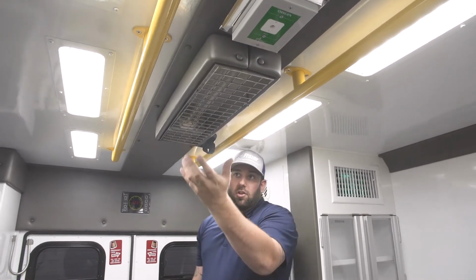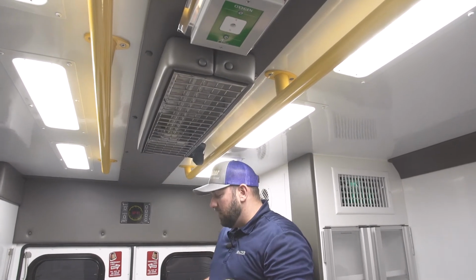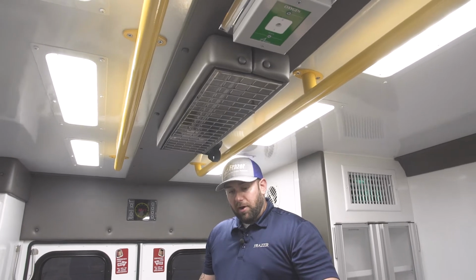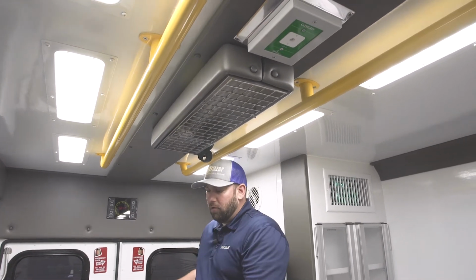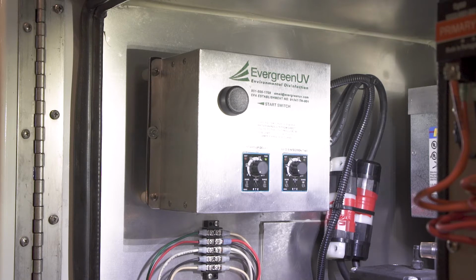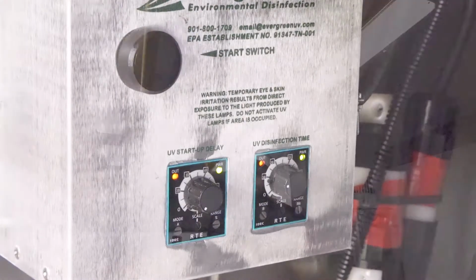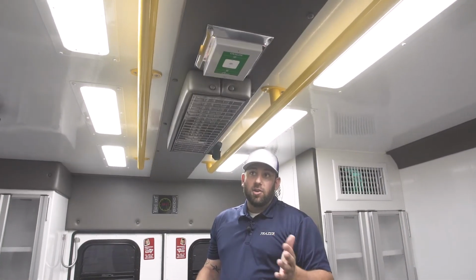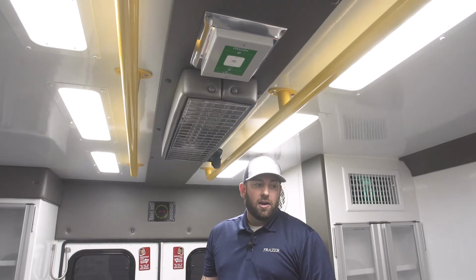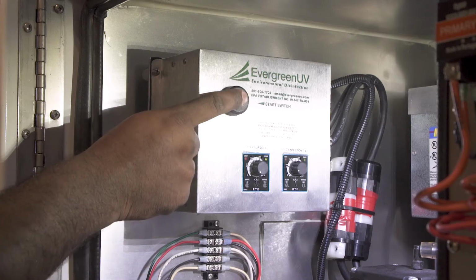So the light fixture is here. To activate it, all the doors have to be closed, and no people are going to be inside the vehicle. So you'd exit the vehicle, close the door, and then there's a control box for it in an exterior compartment. It has a preset delay start timer on it, and it also has a preset adjustable duration time. So we recommend you keep this on for about 30 minutes back here. So you'll preset those knobs, you hit a go button, and this light will come on.